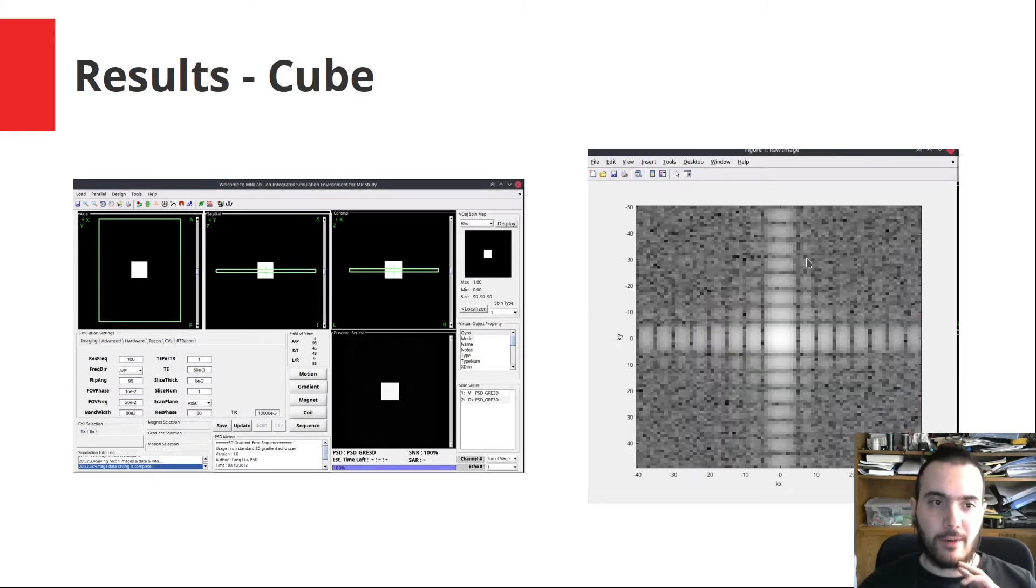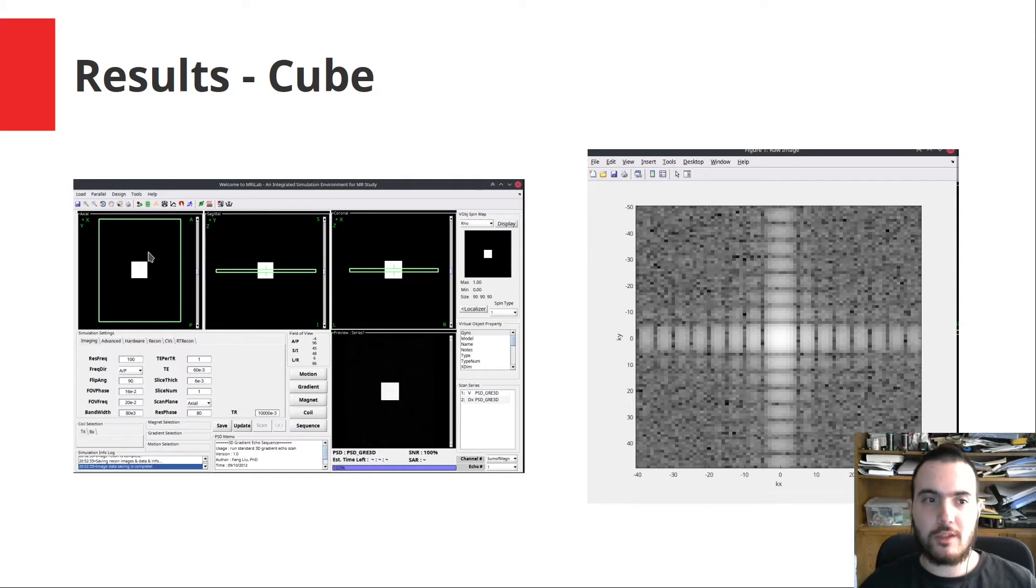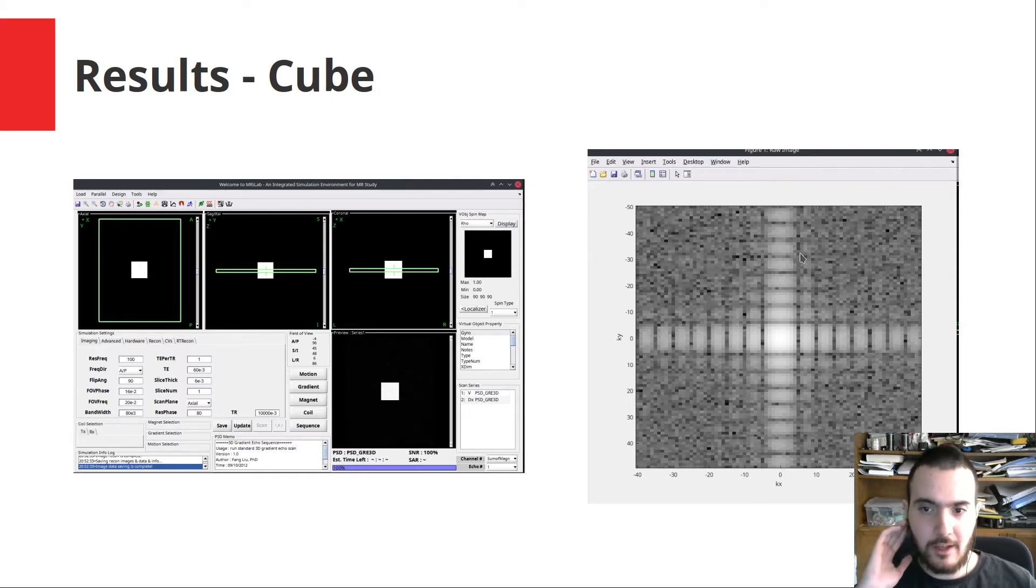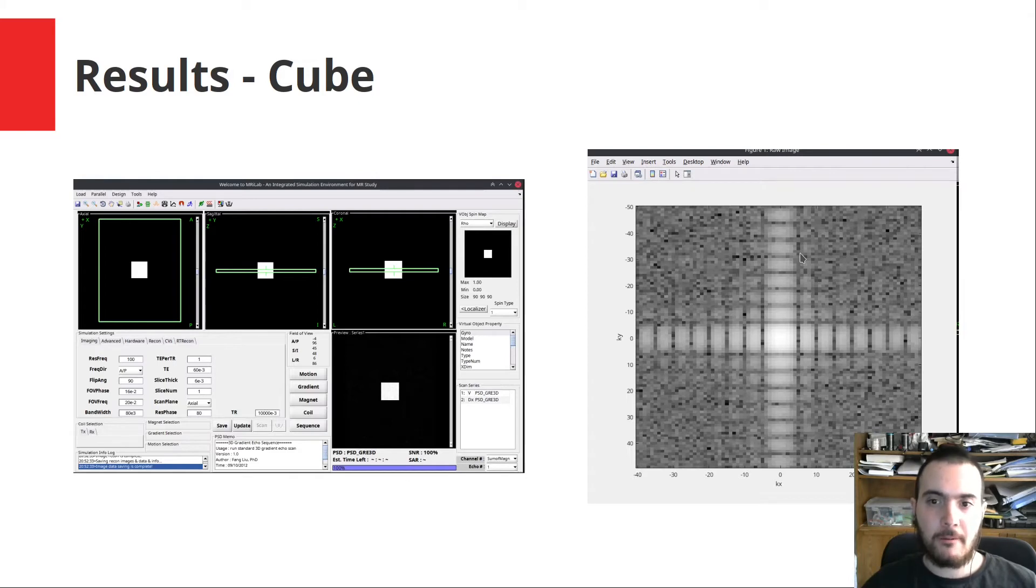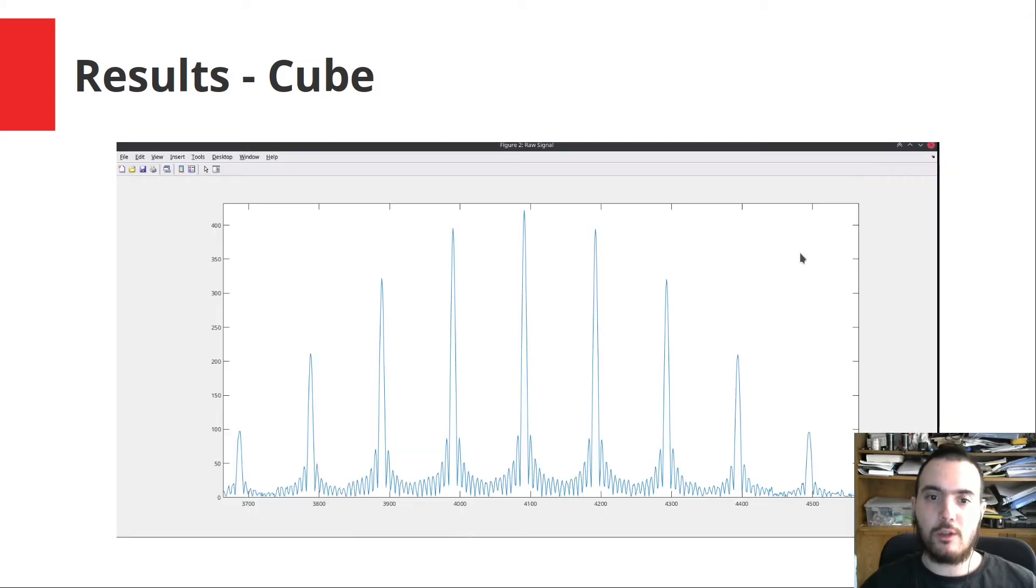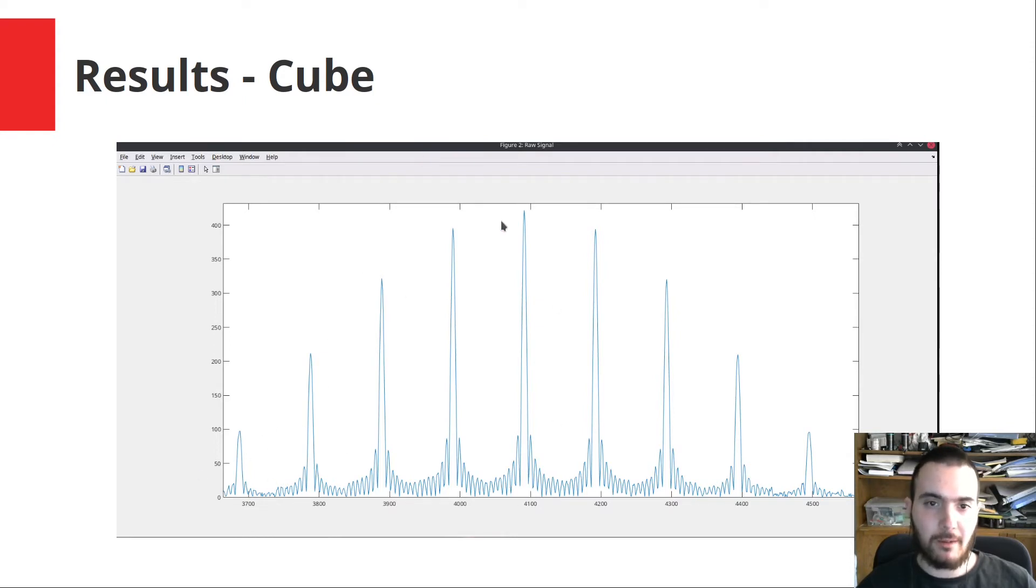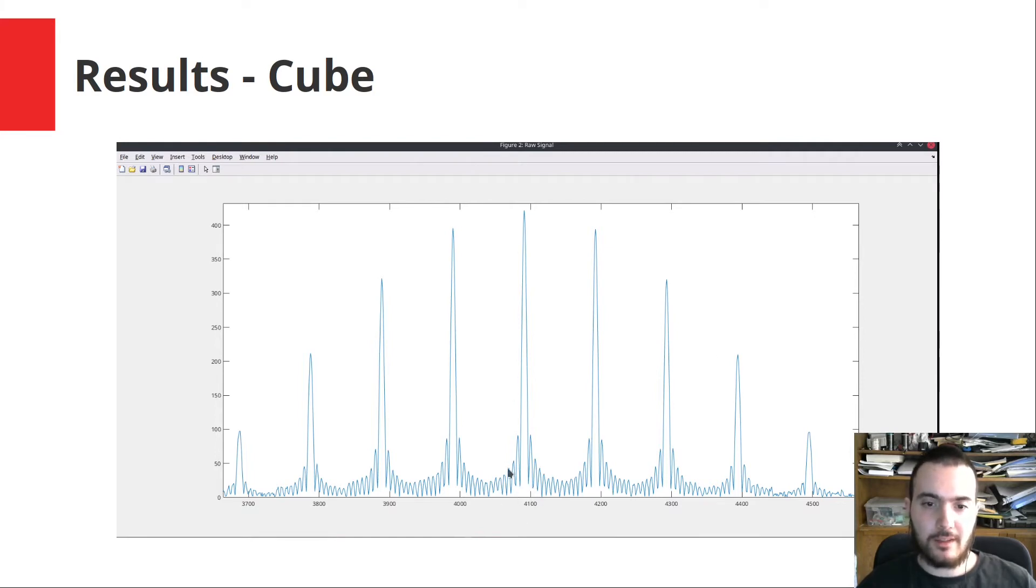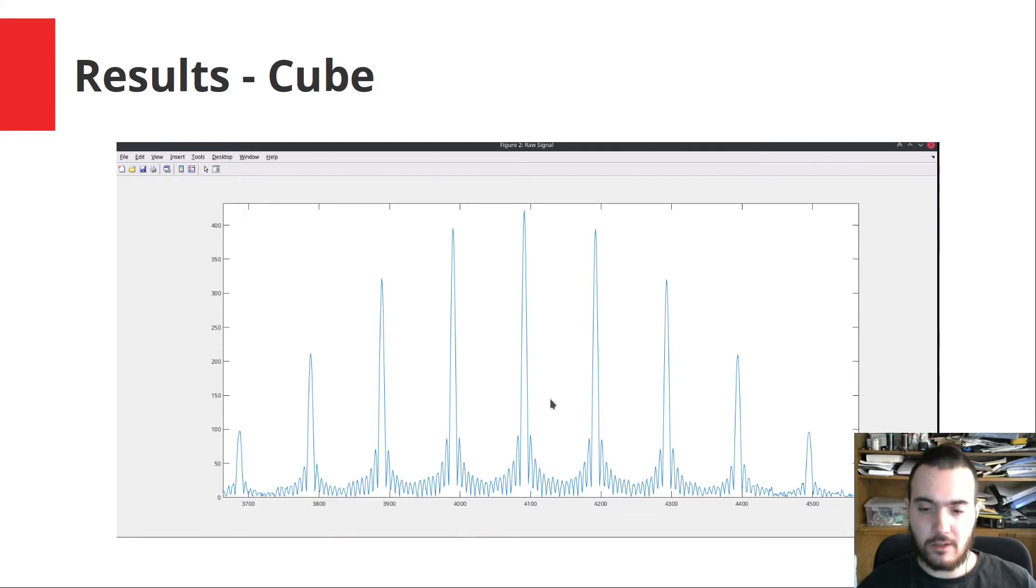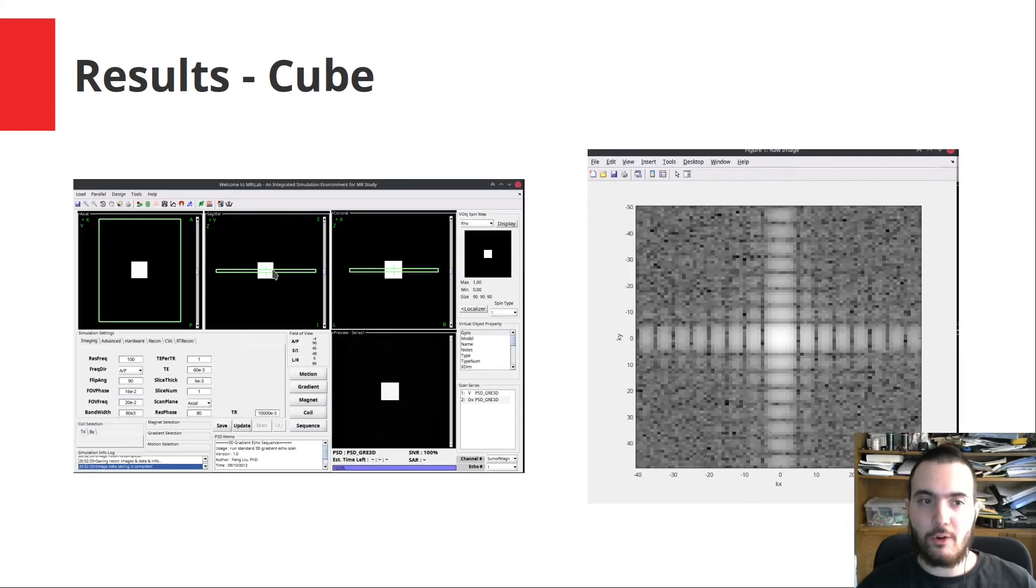When we image a cube object, we see the cross section is a square and this corresponds to a 2D Sinc function in the raw k-space. We can also look at the raw signals. This is a signal from the resulting cube image. One thing to notice is that we have these echoes growing in magnitude and then decreasing again, where this corresponds to the echo time. We can also see that the envelopes of these signals look like Sinc because the original image was a rectangle function.